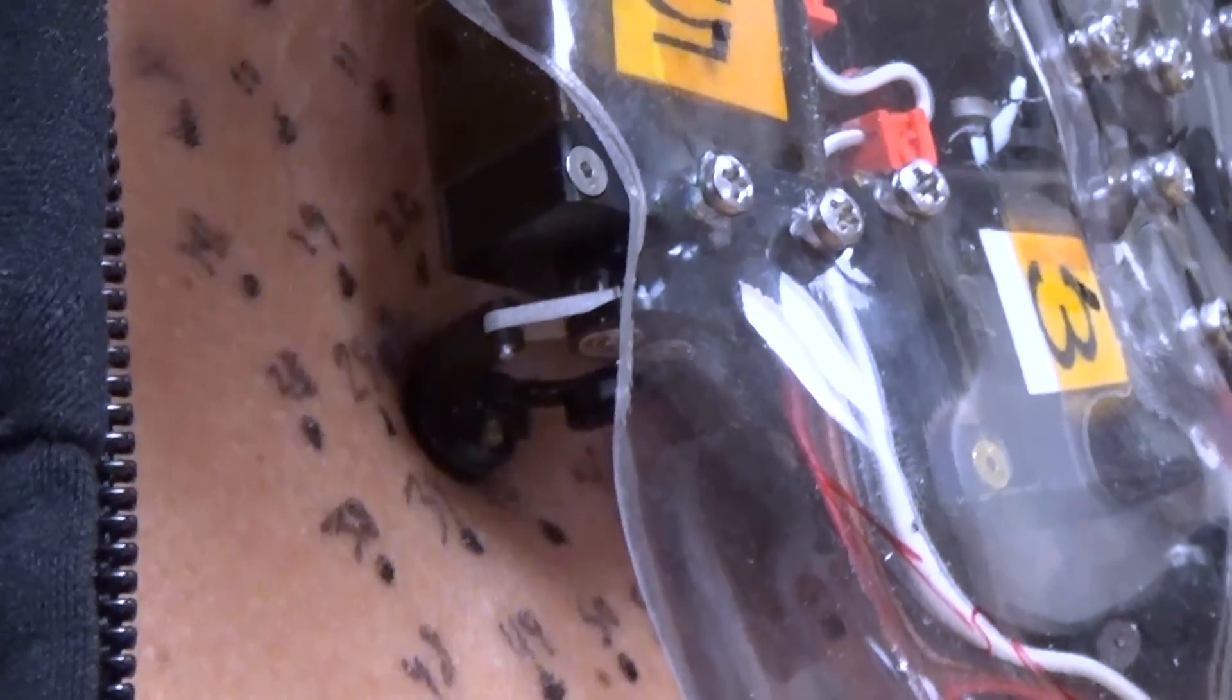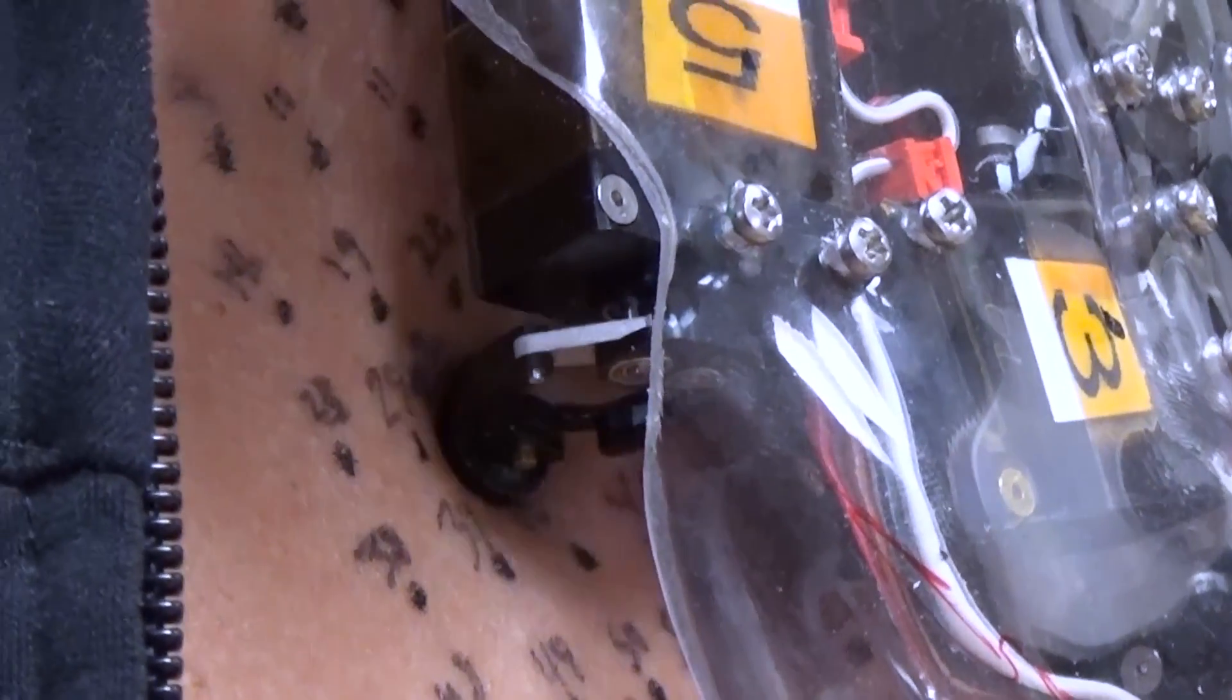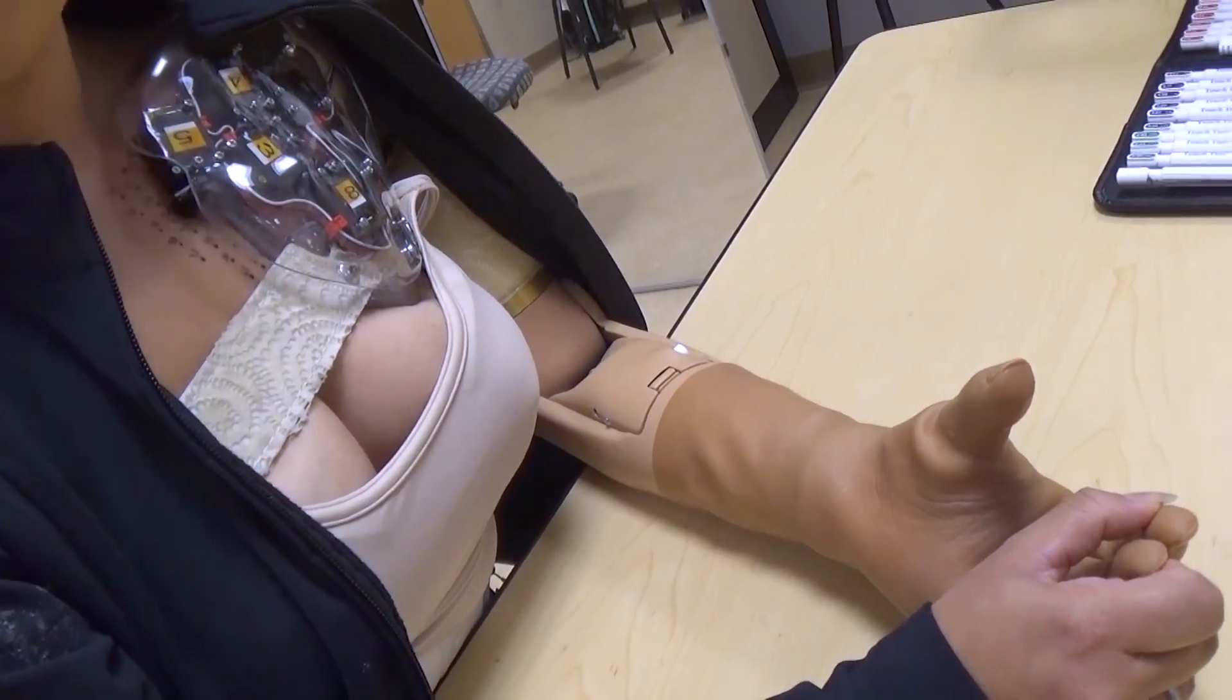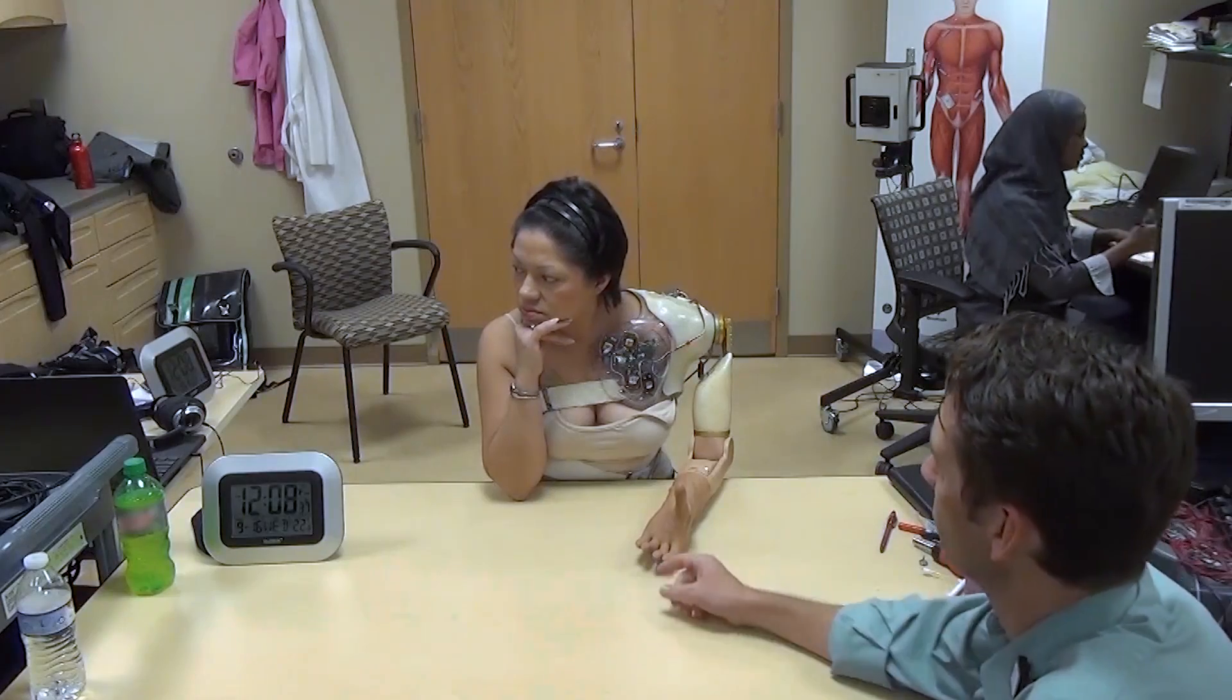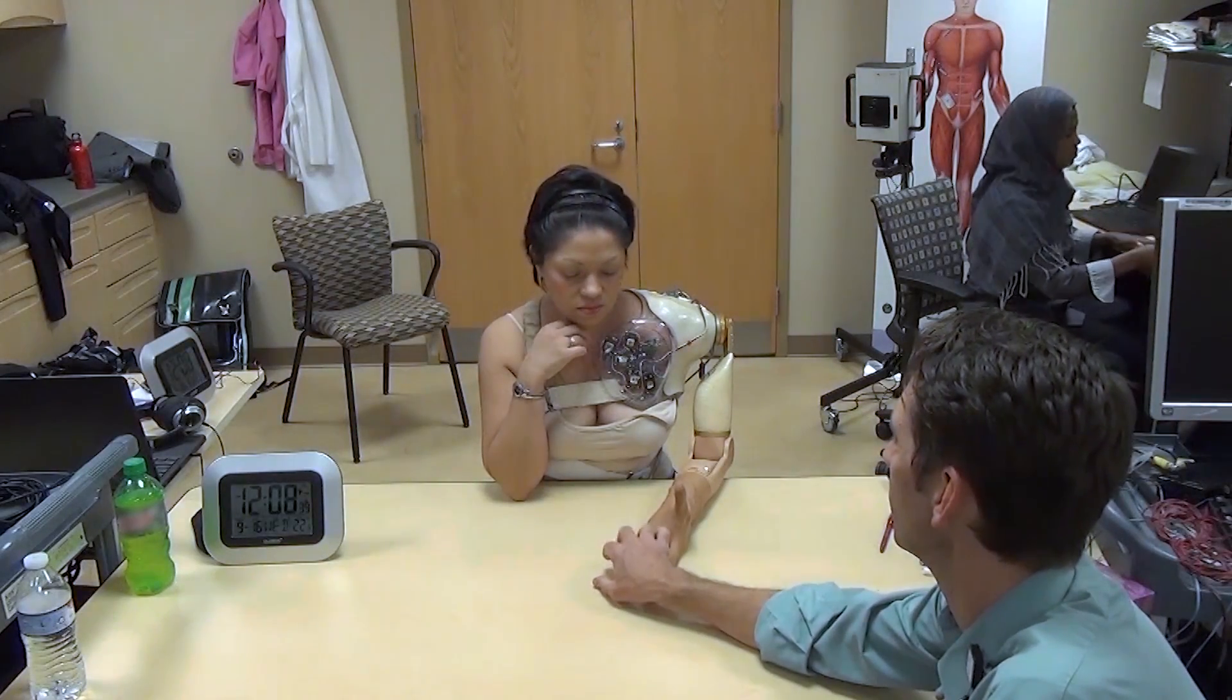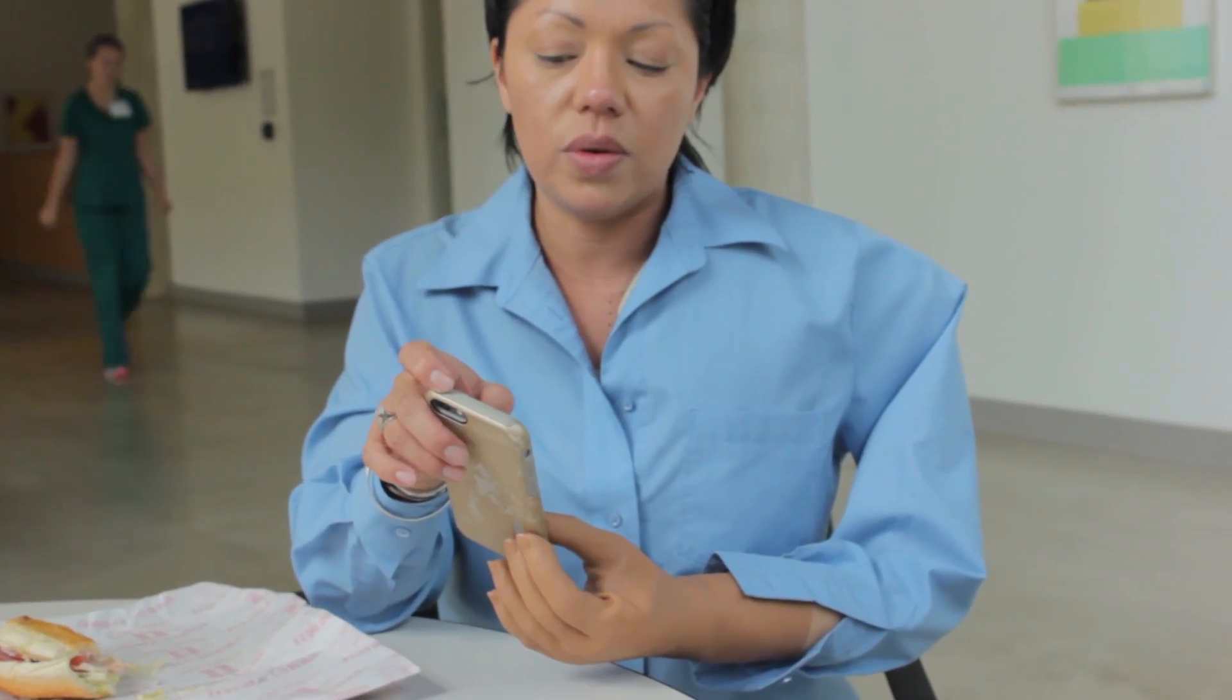Her robotic limb is bi-directionally integrated with her. She thinks about moving her hand and it moves. She feels each of the fingers and palm of her prosthesis as though they are her missing fingers and palm.